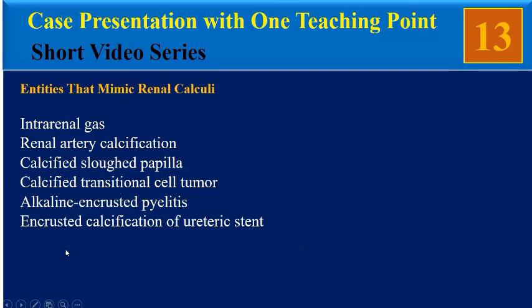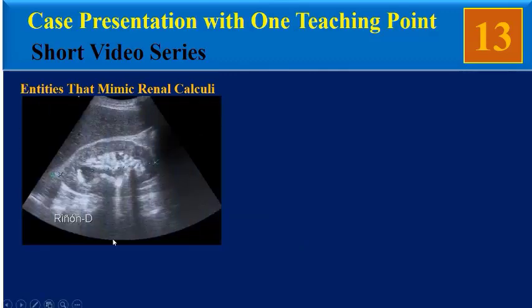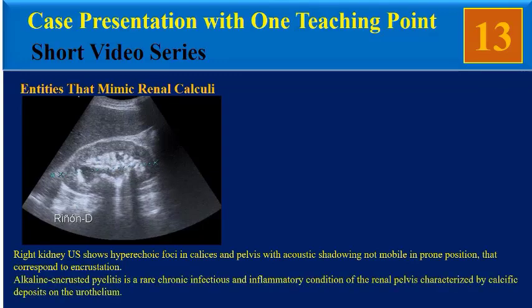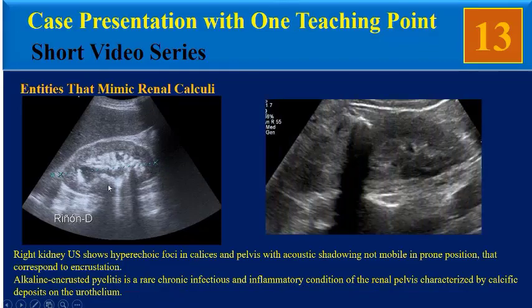Another entity is alkaline encrusted pyelitis. This transverse sonogram of the right kidney shows hyperechoic foci in calyces and pelvis with acoustic shadowing, not mobile on prone positioning, corresponding to encrustation. Alkaline encrusted pyelitis is a rare chronic infectious and inflammatory condition of the renal pelvis characterized by calcified deposits on the urothelium. Our patient is not compatible with this entity.